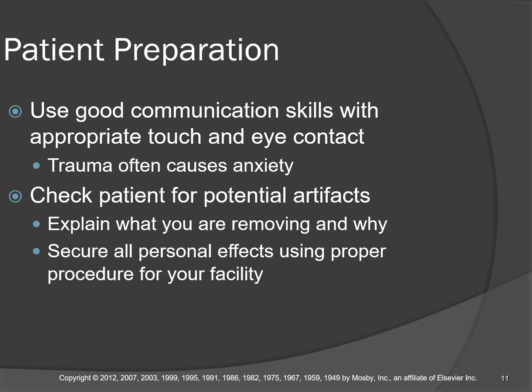The trauma patient might actually be dying, or just in the most pain that they've ever had. Their neck might be broken. Okay. I x-rayed a man with a broken neck. I communicated to him. I said, it looks to me like you might have a broken neck. So we've got you on this backboard and we've got you in this collar.